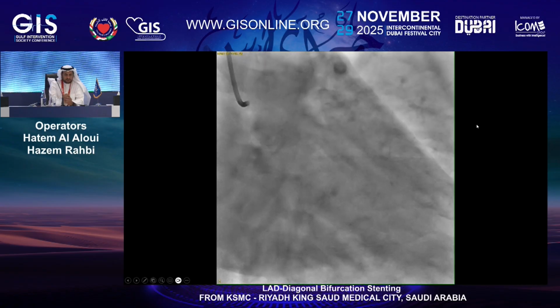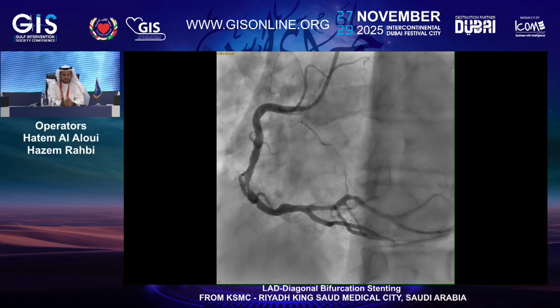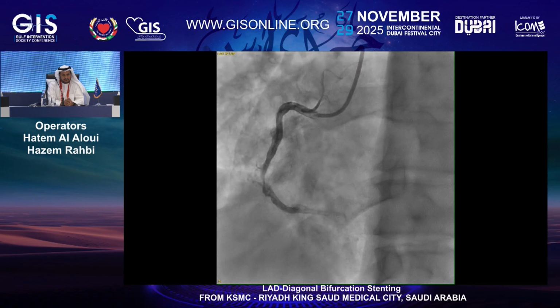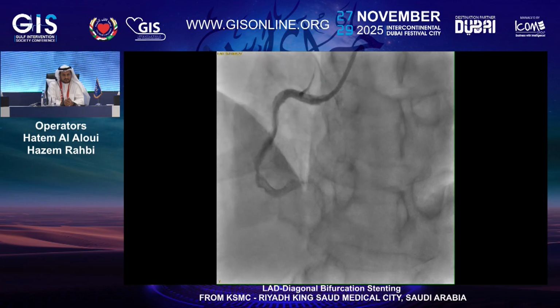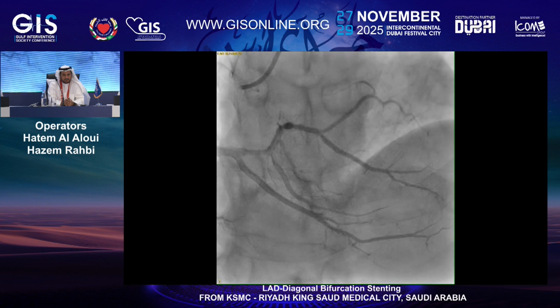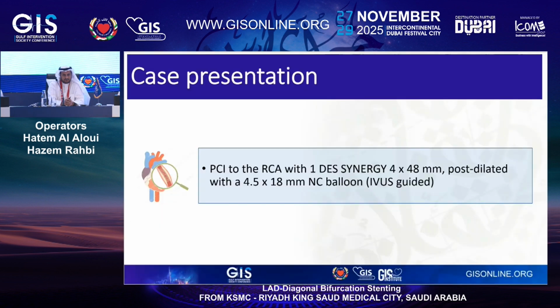And this is the culprit lesion, actually, the mid to distal RCA. TIMI 3 flow with quite a nasty lesion. So our buddy and friend Hazem did the PCI at that time. He put a drug-eluting stent, a Synergy 4x48, optimized IVUS guided, and post-dilated at 4.5.